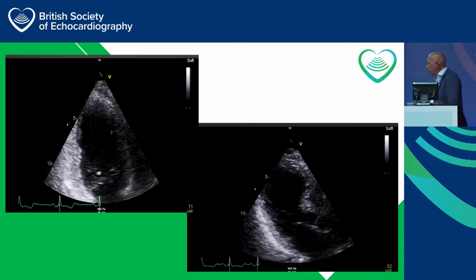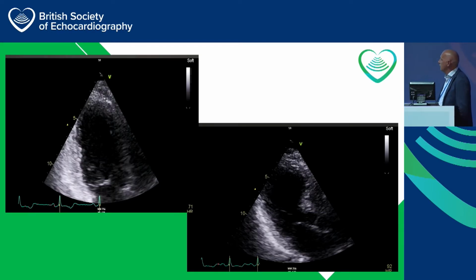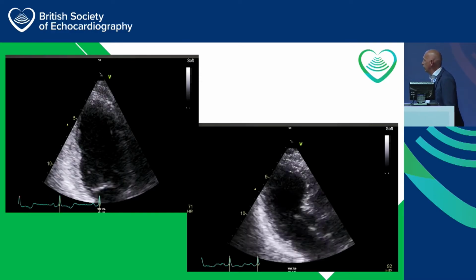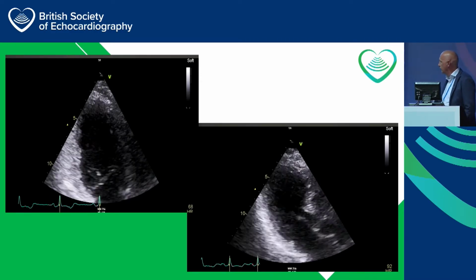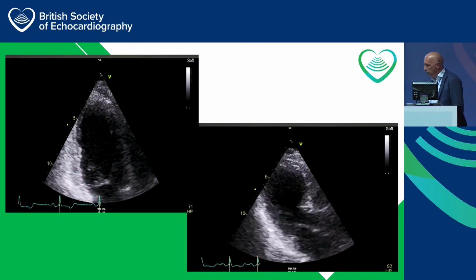This is her 2-chamber view, so again you can see quite nicely, so mid to apical anterior wall with inferior involvement, infralateral involvement down to the inferior apex here, and again the same concepts of the anterior septum with the posterior wall.